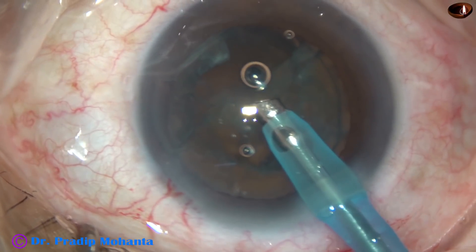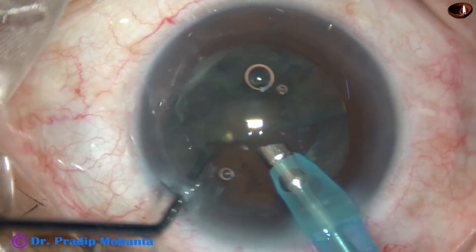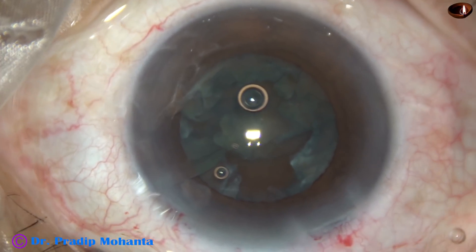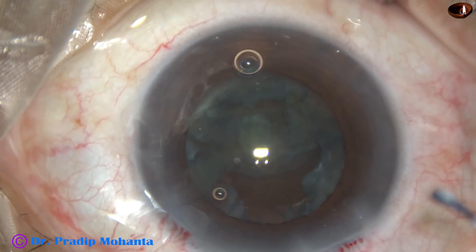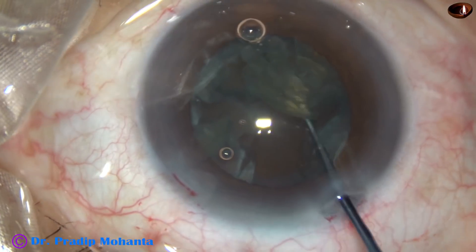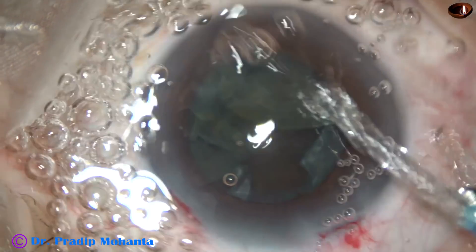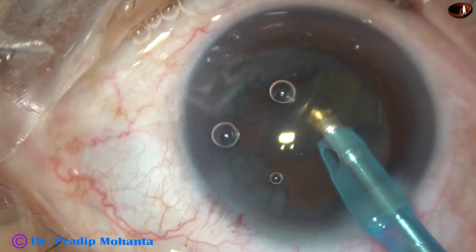Now, what to do with the rest of the lens matter? It is rotated, and we must try to lift it up if possible, but I could not. So again, inject some viscoelastic and use that blunt instrument — a spatula kind of thing — being used to lift off the lens material. And now it is safe. Now we can emulsify this elevated lens material very safely.